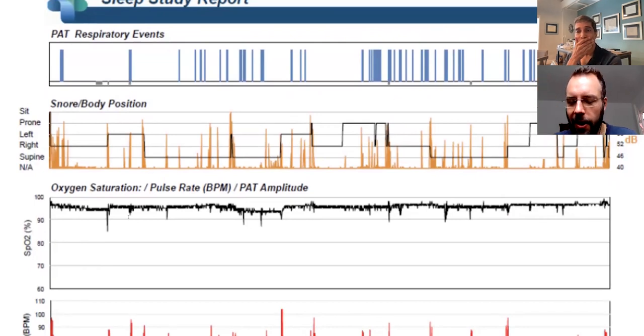Oh, side question. I was looking at literature. My memory is very vague, but I was looking at literature that was trying to correlate the severity of subjective daytime symptoms and objective channels. And I think movement was like either one or two, highly, highly correlated with bad sleep. Did you read anything like that? No, but I mean, I've done sleep studies for years. The more kinetic someone's sleep is, assuming they don't have PLMs or whatnot.